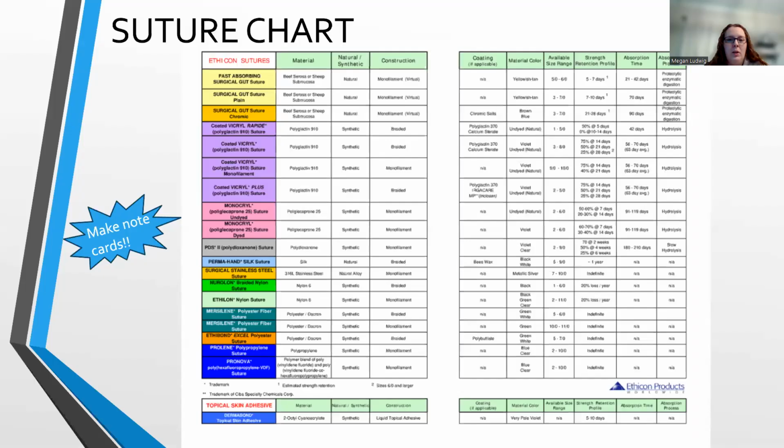Weird. All right, so here, it looks overwhelming, I know. You've got this broad suture chart here that is talking about all the different types of suture. Actually, this probably isn't even all of them. There are others, I think, that are not included, but I wanted to give you a good overview as to what you would be seeing, okay? So what I would highly recommend you do is, in whatever fashion you like to use, whether it's Quizlet or old-fashioned note cards, make note cards of these things. Quiz yourself. I can't stress enough how important it is for you to know your sutures, okay?